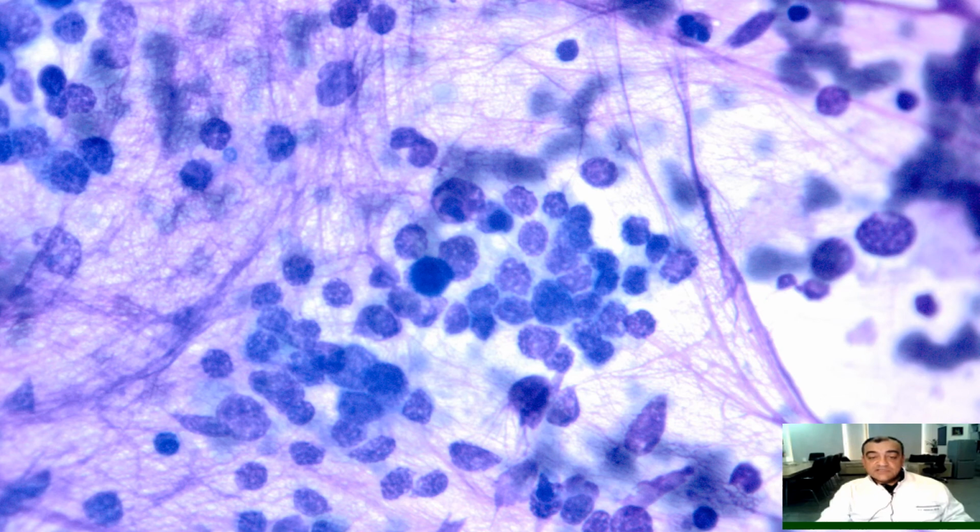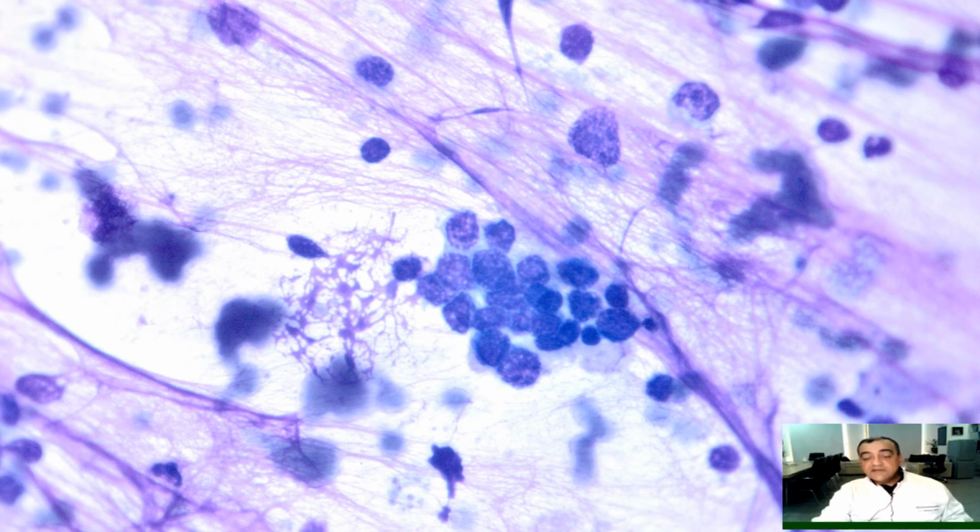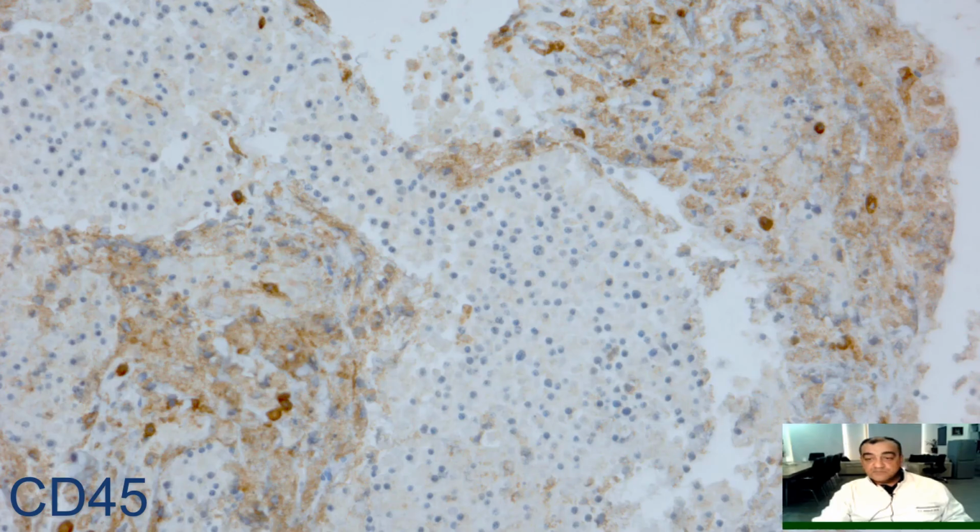And sometimes pathologists are obliged to deal with fine needle aspiration specimens. Here on the fine needle aspiration, the neuropils can be easily and very nicely seen on a background of relatively cohesive neoplastic atypical round cells. CD45 excludes the hematopoietic origin of the neoplastic cells. Here you can see a small amount of scattered lymphoid cells that are positive for CD45, but the neoplastic tumor cells are negative.